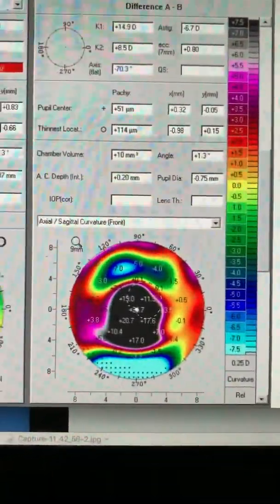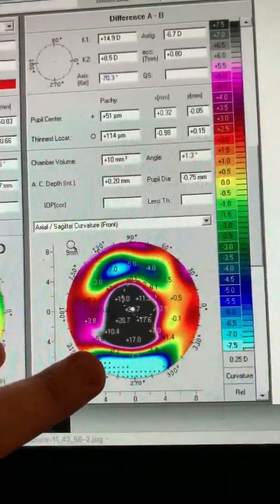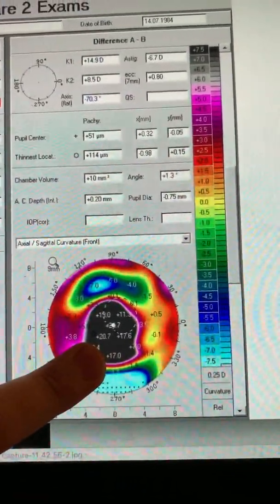And this is a difference map, which I wanted to share with you. We can see a dramatic flattening of over 20 diopters here.